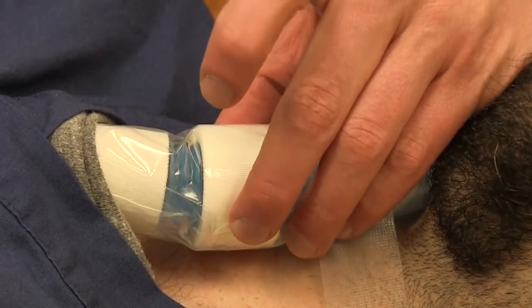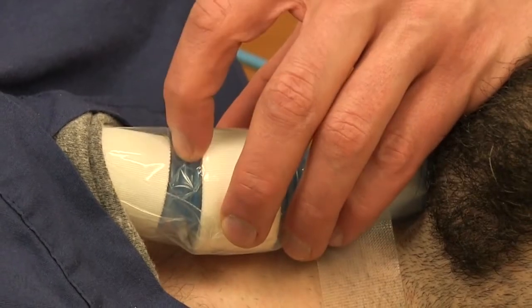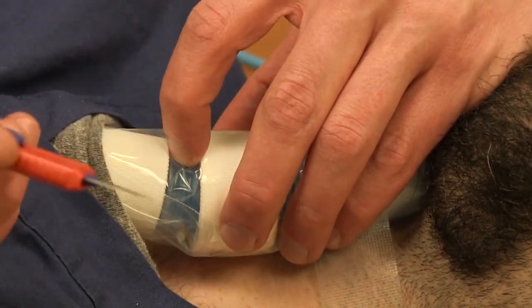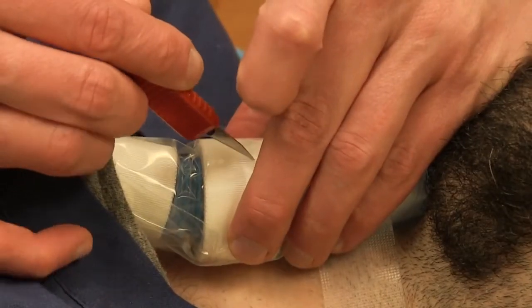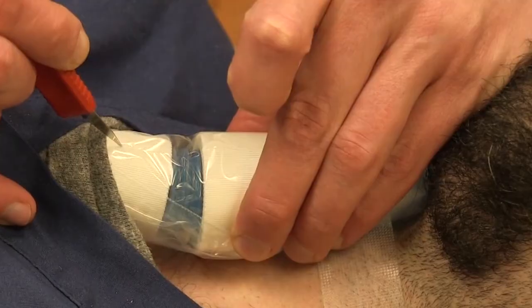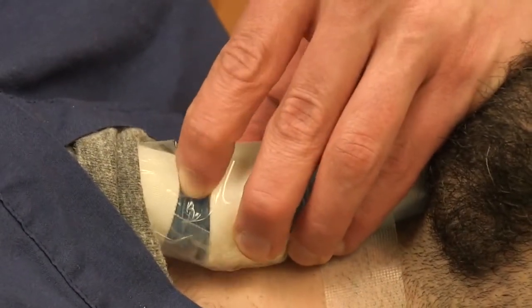Non-dominant hand: thumb and middle finger on the thyroid, touching the membrane with my index finger. I rest my dominant hand on the chest. I'm going to cut from the thyroid through skin to the bottom of the cricoid — about a one-inch incision.